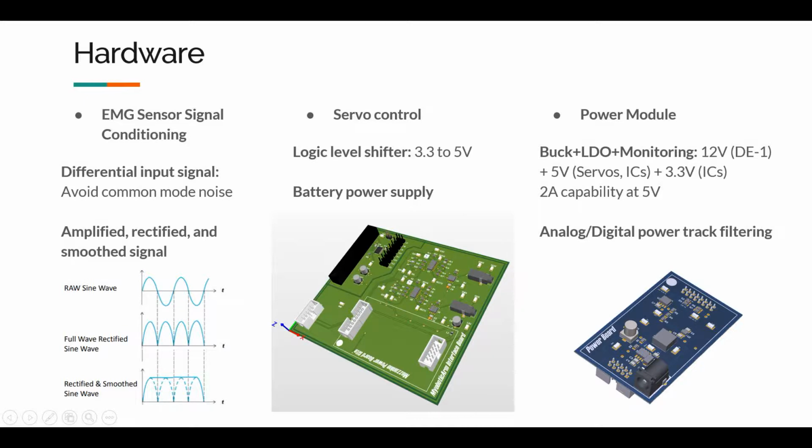So now I'm going to briefly explain the hardware, which is the PCB basically. For the EMG sensor signal conditioning board, we have firstly the 2 differential inputs from the EMG electrode and 1 input for the reference voltage. This is 2.5 volt biased, and the signal range is 0 to 5 volt. So the amplification factor is around 250. After the differential input signal, then we do the rectification and smoothing. That will make the signal better.